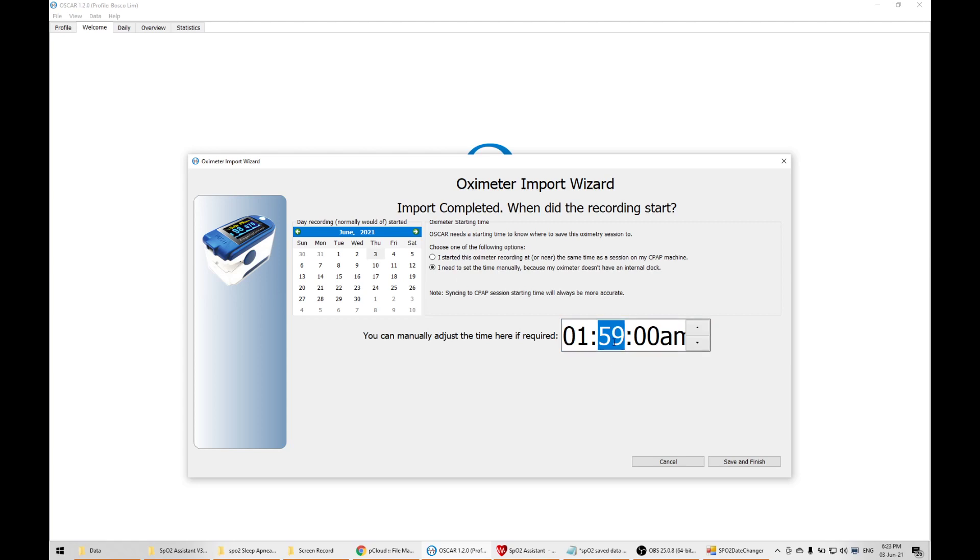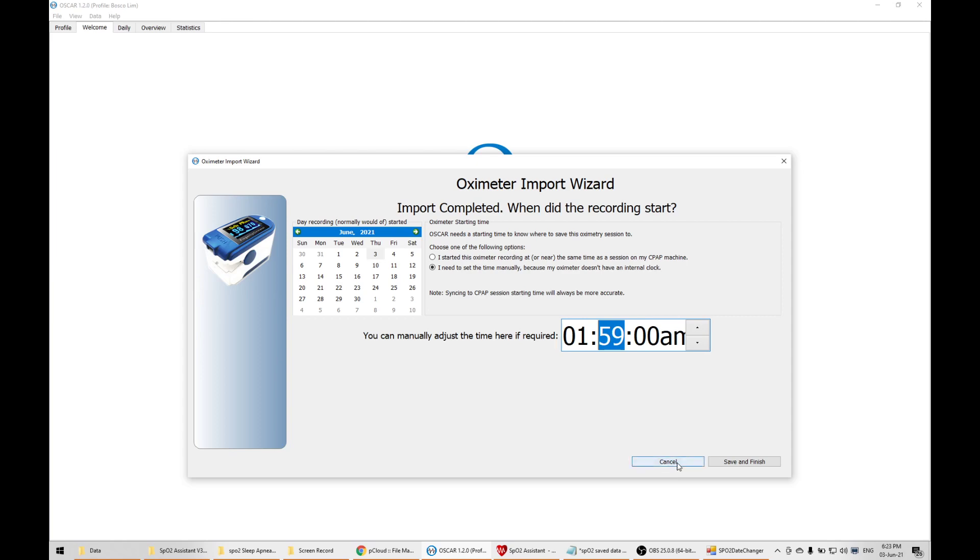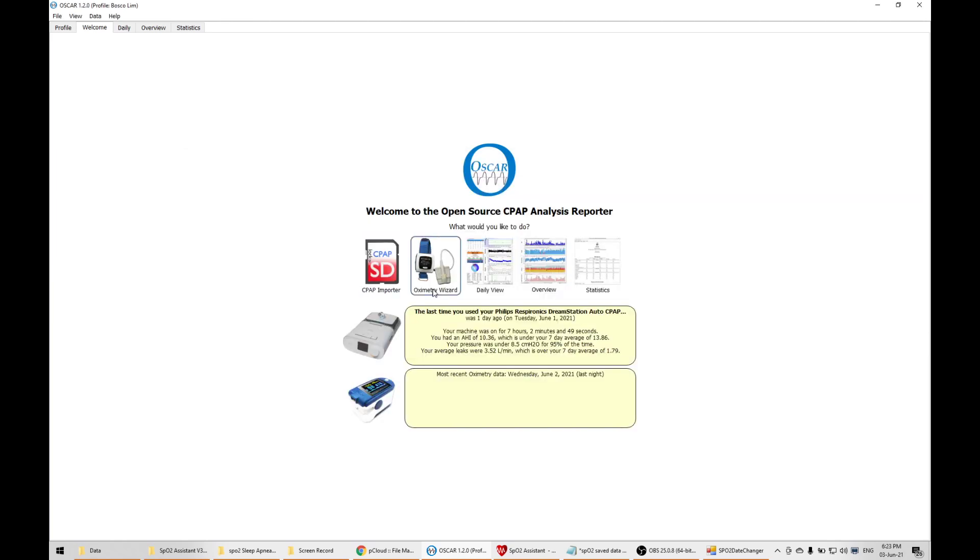The date and time will be updated instead of showing up as zero. If I click save and finish, it's going to match it with my CPAP data. That's how I synchronize both the data from the CPAP machine to the CM50D Plus. Once you've done it, when you go to daily view, you'll see that it matches.